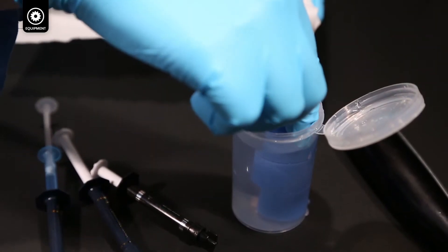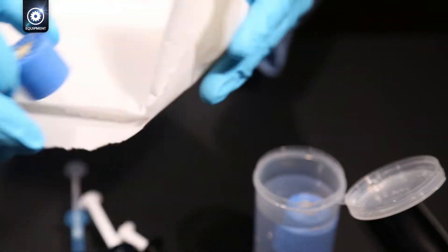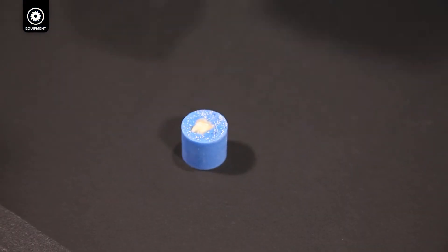Once you have your methacrylate base formed, with the cut tooth embedded in it, dry the specimen with half air pressure at a distance of one centimeter, leaving the surface slightly damp.